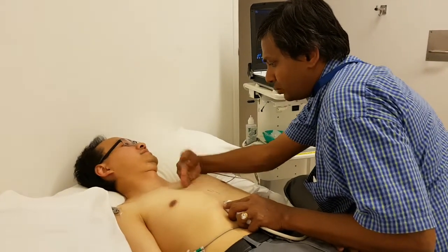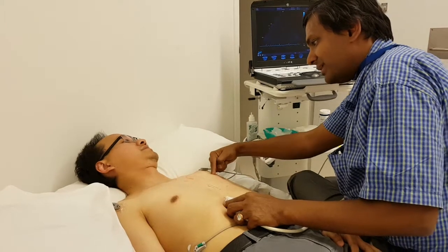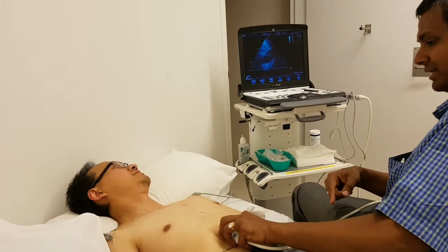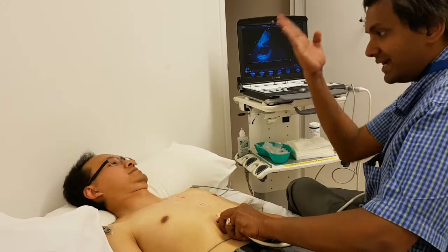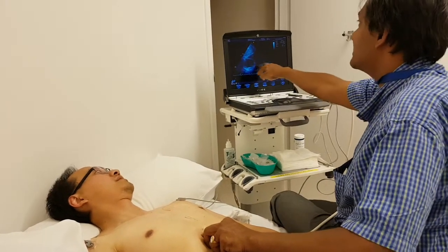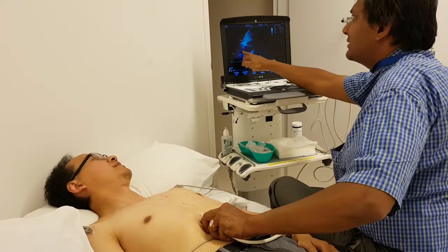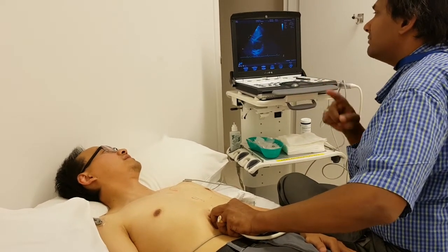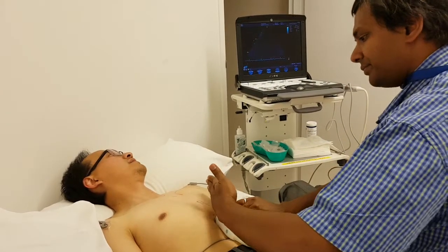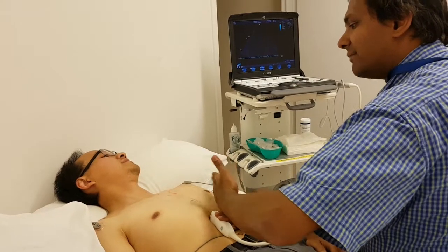You can send the same axis from here — from one, two, three, four levels. What I'm going to do is have the probe marker facing anteriorly, and the beam is now going towards the apex of the ventricle. That's the right ventricle, that's the apex, nice and round — that's a short axis view. And that structure there is the mitral valve. If I want the apex, I have to sweep the probe towards the left arm, and if I want the aortic valve, I have to go towards the clavicle.